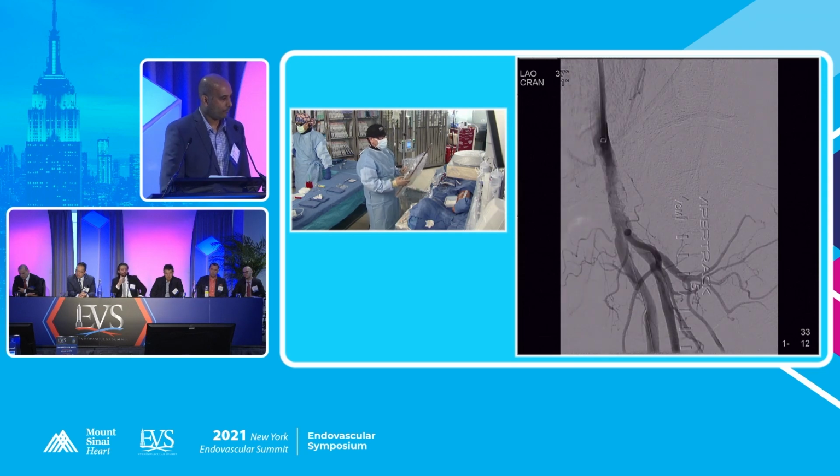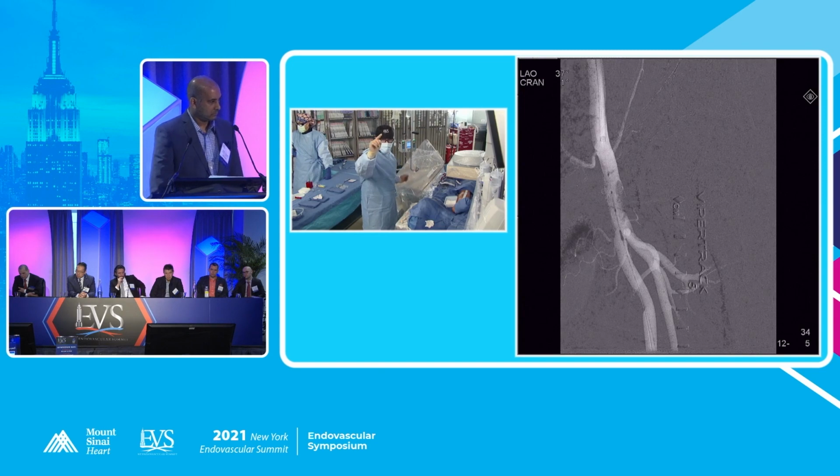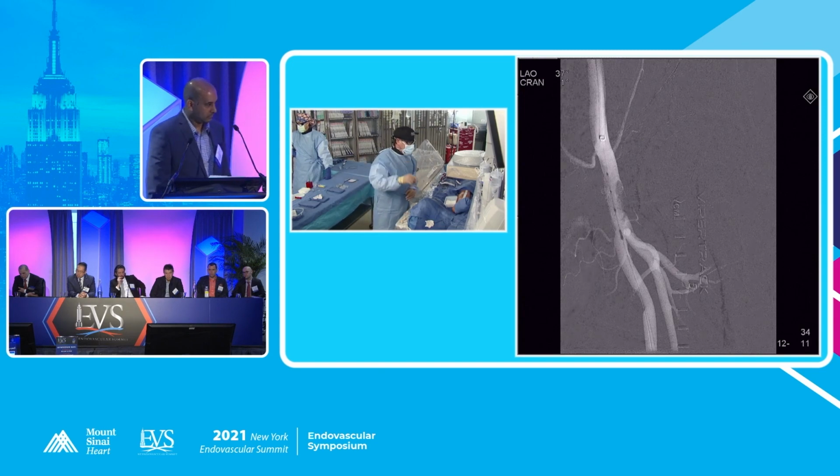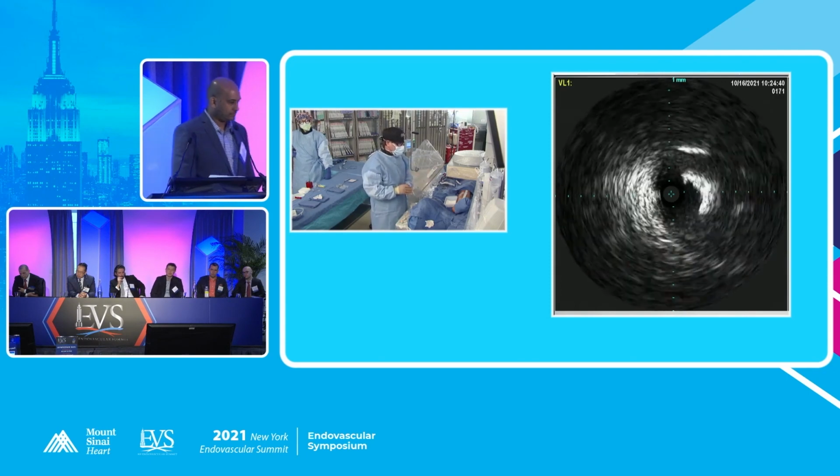All right. Now, several minutes later, so now we do IVUS. Now I want to show the before IVUS, please. Can we let them get the IVUS up. Okay. This isn't even its worst part, but it gives you an idea. There's heavy, chunky calcium everywhere.